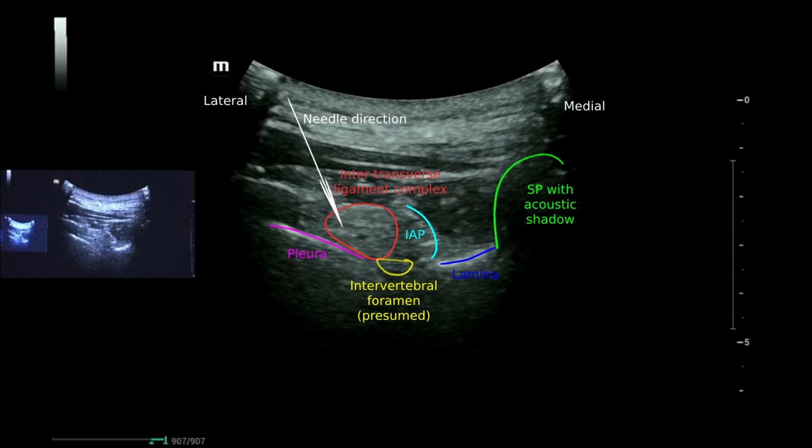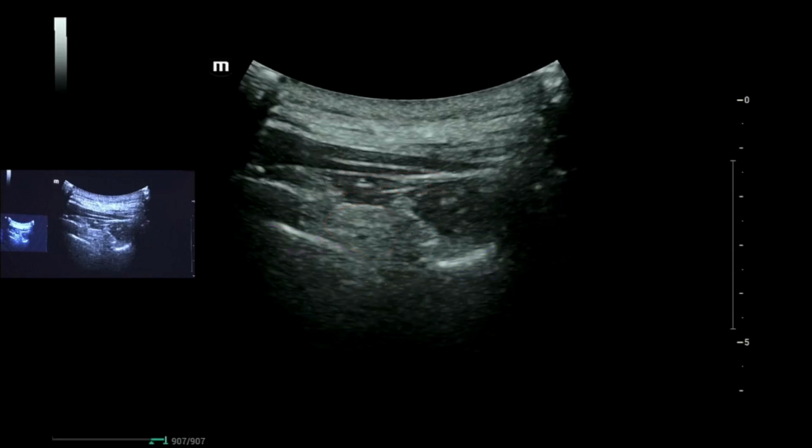Today, there is evidence that a needle placed too lateral is not desirable. The efficacy is better when the needle is more medial and the injection is performed more medial. So I wouldn't say go close to here, somewhere in between over here, okay? Now, this is the traditional paravertebral anatomy, okay? But I apologize, Shah, because of the way the images are depicted, can I try the other machine? Yeah.